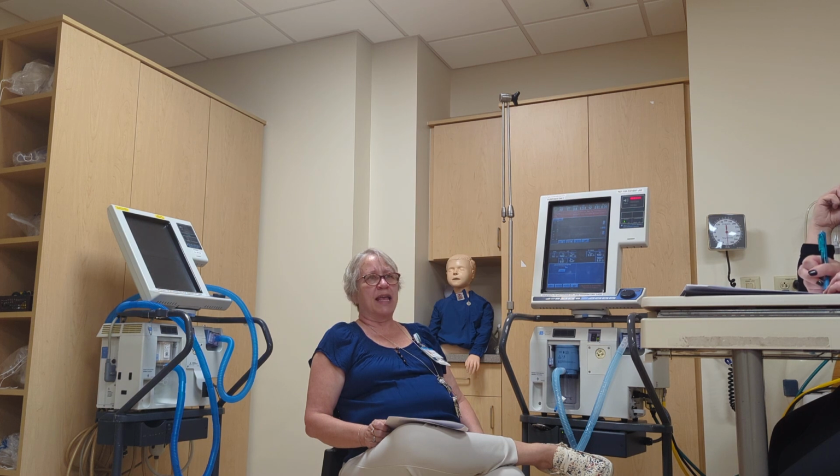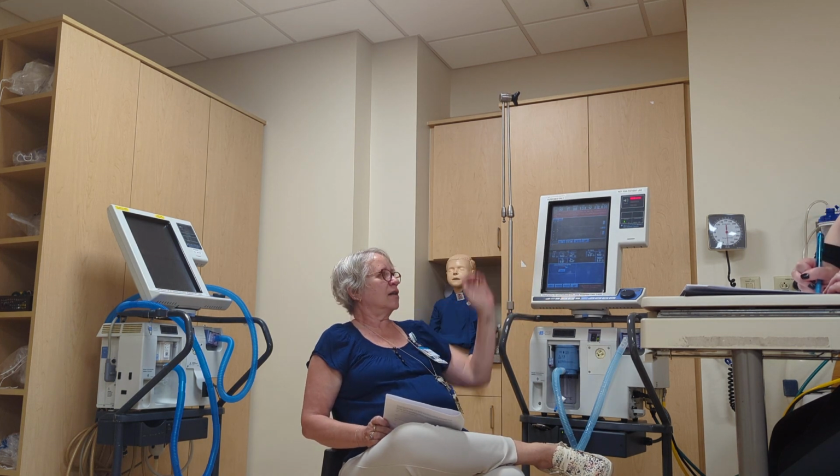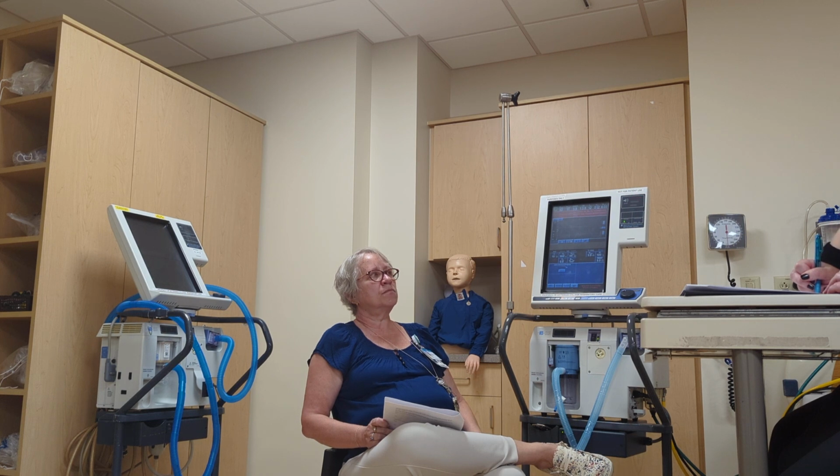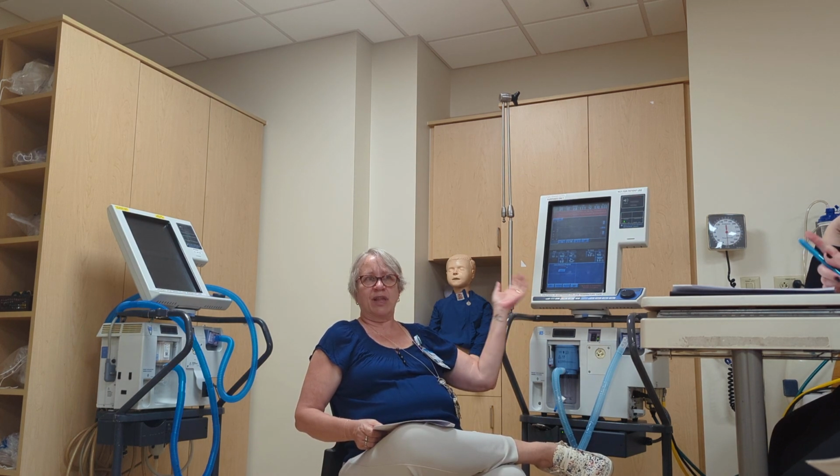Now, in order for me to deliver the correct tidal volume, what would I have to set my tidal volume at? 520. 580 would. How much am I losing? Oh, you're right, 78. 580. I can't math. So I need to set it at 580 milliliters.